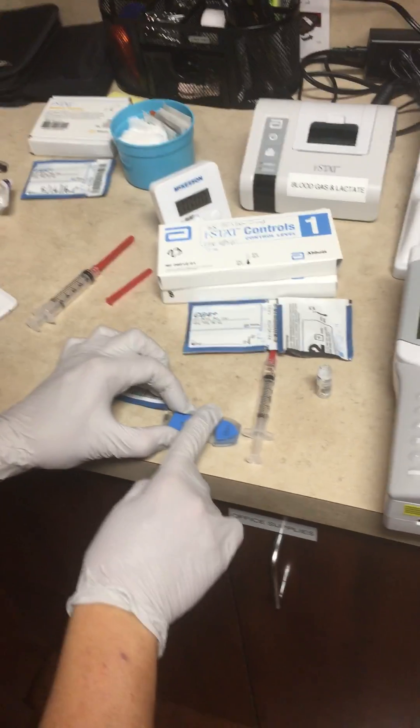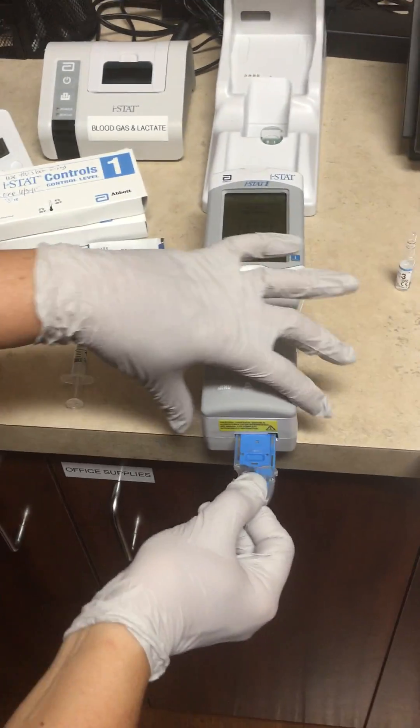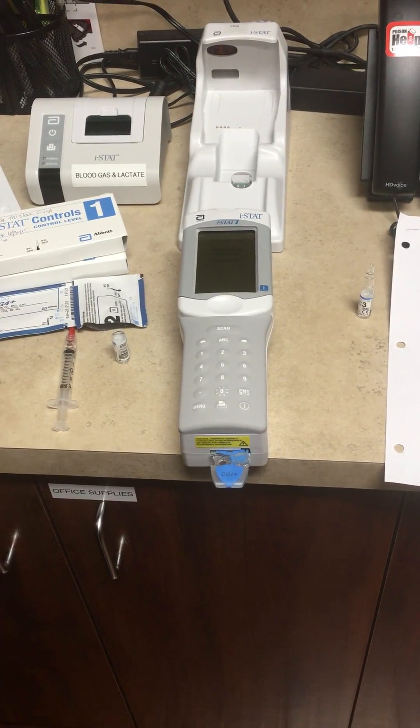Fill it until it reaches the top of the clear line, and then this little stopper goes over on your sample. I turned the cartridge sideways when I inoculated it to prevent myself from touching the sensor end. And now our test has started.